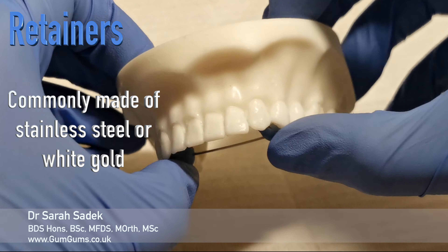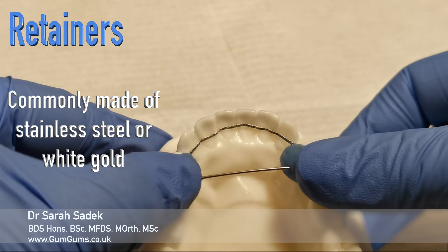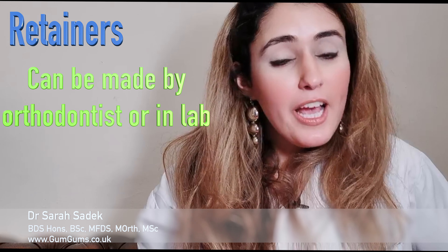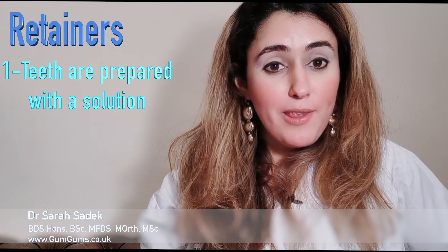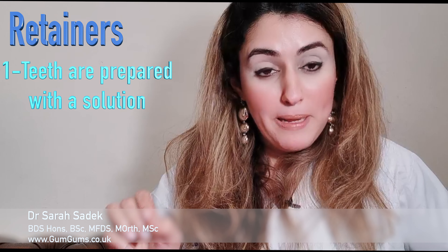What are they made of? Fixed retainers are commonly made of stainless steel or white gold. After you have finished your orthodontic treatment, your orthodontist can normally fit these retainers straight after your treatment is complete. We don't often need to get these lab made, although sometimes we do. The first thing we do is prepare your teeth using a special solution to make sure the wire sticks properly.